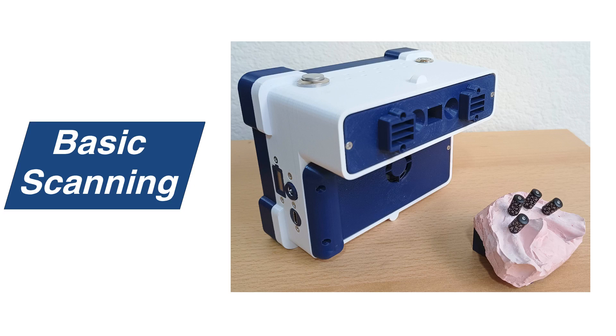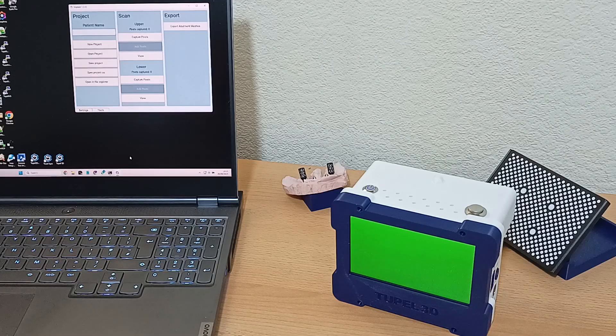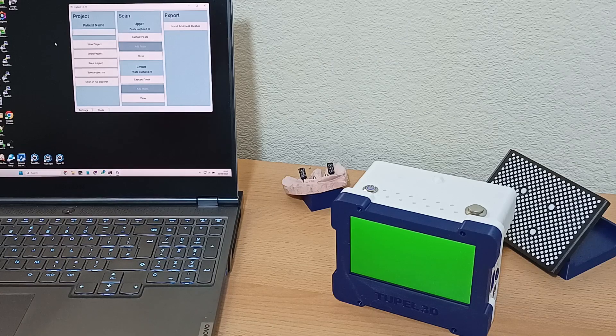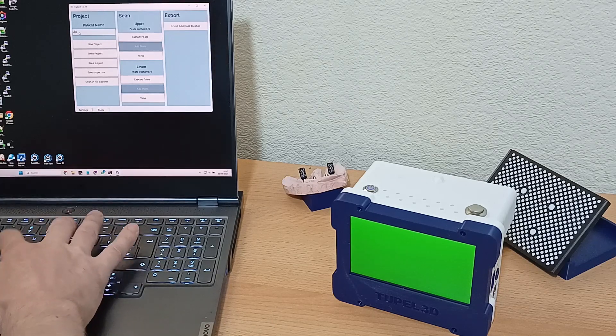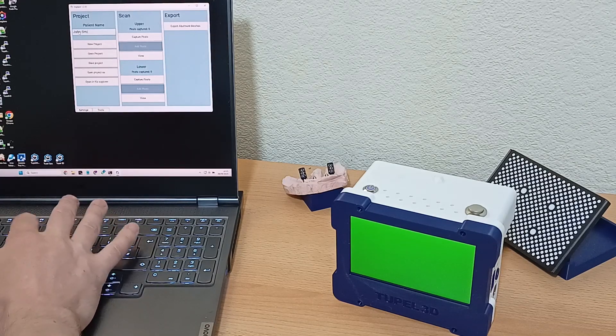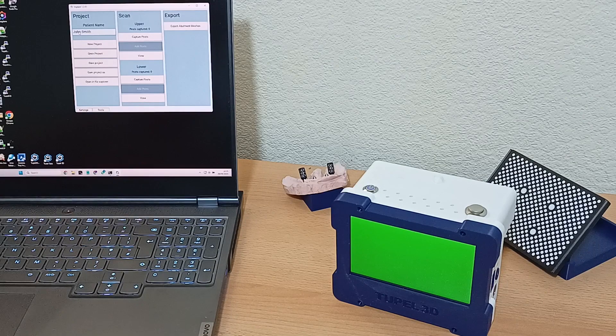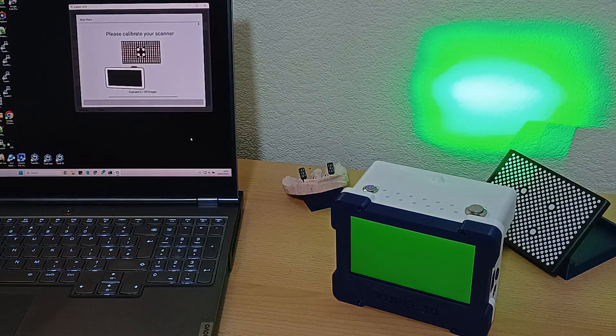Let's quickly go over the basic usage of the tuple 3D implant scanner. I've got the software installed, so I type in the patient name and click scan posts.